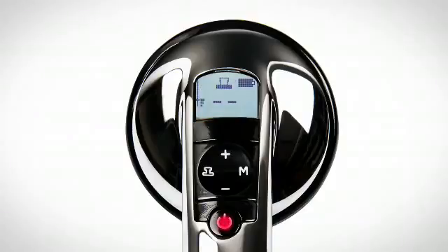To increase amplification, press the plus button until you reach the desired level. To decrease amplification, press the minus button.